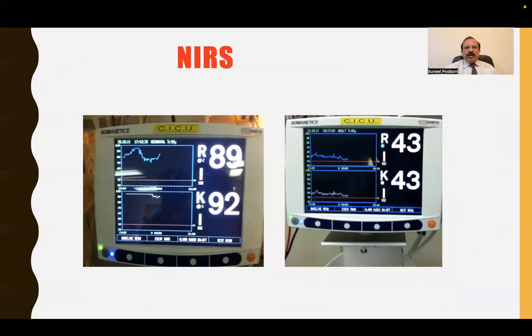If there are very high saturation levels over the brain, that is also not very helpful as an index. The reason is that there is a lot of oxygenation available in the tissues, but the brain is not picking it up. So there must be some sort of problem. It could be a temporary problem also, such as at the level of the mitochondrial utilization of the oxygen. So the high numbers as well as the low numbers are significant, but they tell us that something could be wrong.